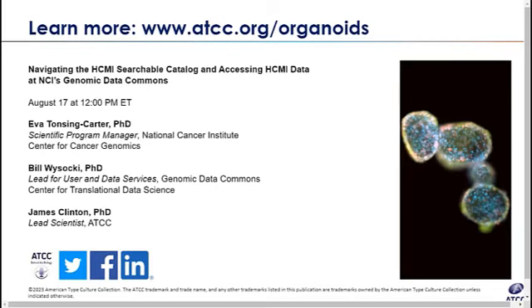So again, we recommend sticking with the kits because that's how the models were derived and manufactured. Any deviation from that comes with some amount of risk, and it's ultimately up to the end user to validate that in their particular application. Maybe it'll make a difference, maybe it won't, but we can't tell you what impact it will have because we have not done every possible formulation comparison, homebrew or commercial, with the 100 plus organoid models we currently have.